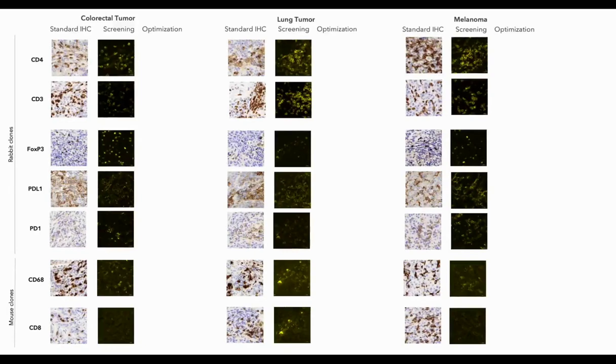It is widely accepted to employ tonsil samples during the early optimization of immune markers due to the easy access to tissue and the abundance of the expression of such markers. However, this comes with additional difficulties. Very often, we need to perform some re-optimization steps once we transfer to specific tissue types.